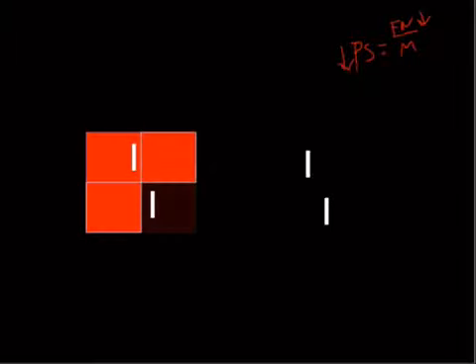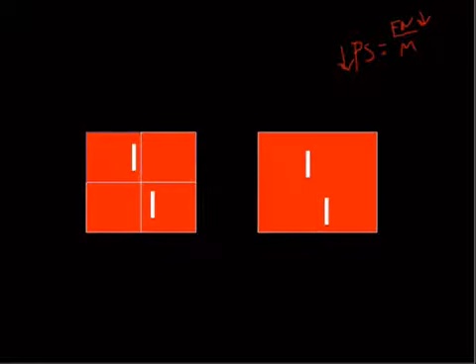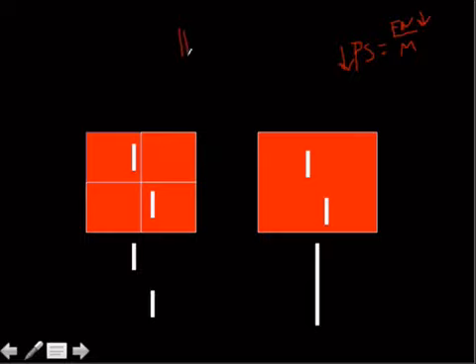So think about it like this. Here's four small pixels. We're trying to look at these two little bars that are close together. And then here's one big pixel. So with these four small pixels, we're going to be able to see that there's two different bars. We've got one in each pixel here, and these two pixels are blank. Now this one here is a single pixel, and it's going to get averaged together. It's going to look like one, so we couldn't tell them apart. And that's what spatial resolution is. Spatial resolution is the ability to tell that two things that are close together are separate, as opposed to something like this, where these two lines are right on top of each other, and you'll say there's only one of them instead of two.